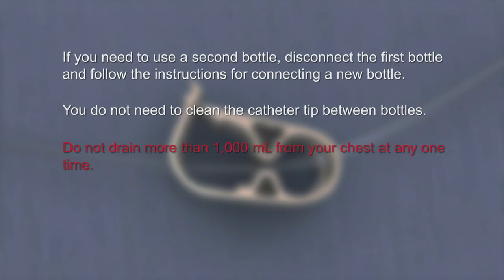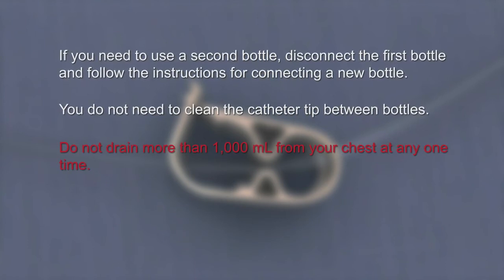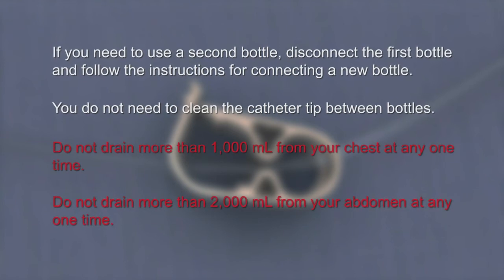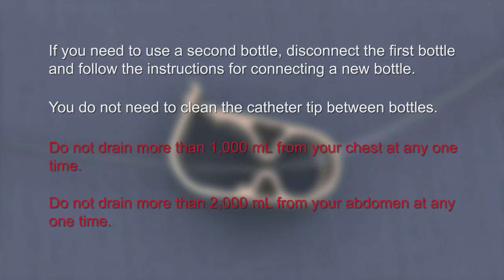Do not drain more than 1,000 milliliters from your chest at any one time. Do not drain more than 2,000 milliliters from your abdomen at any one time.